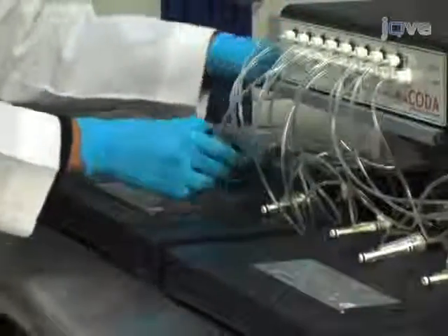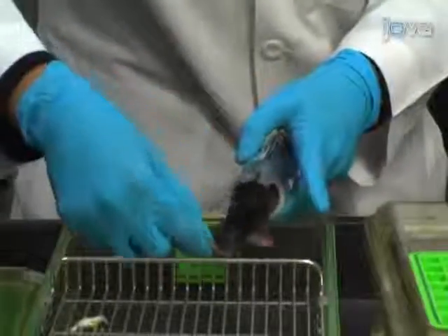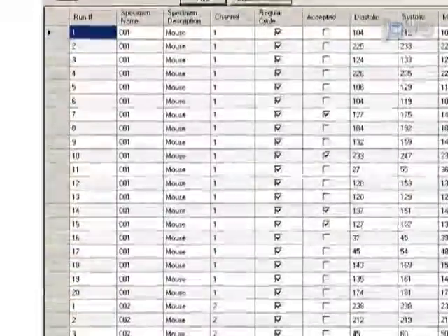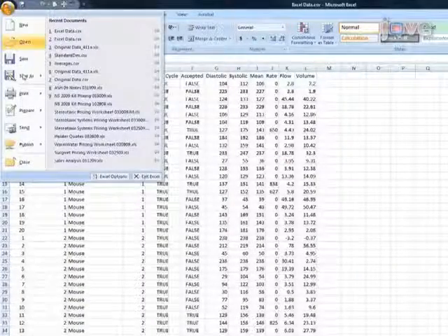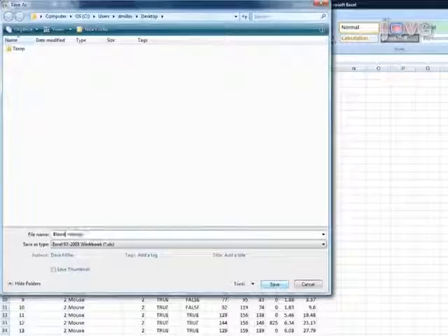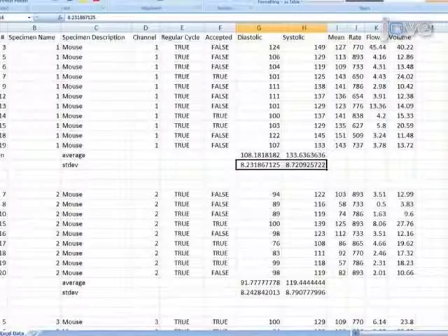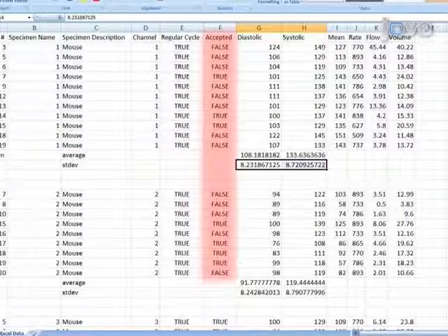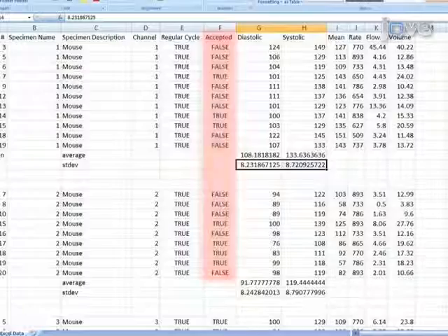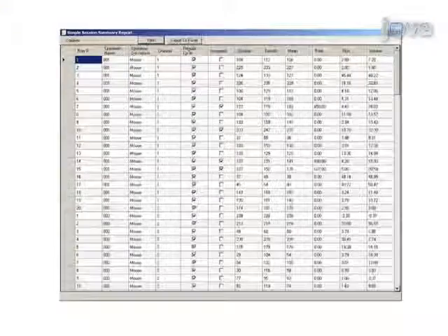When the experiment has ended, remove the animals immediately from the cuffs and holder. A simple session summary report is displayed. The data collected in the experiment is saved as an Excel file. A common practice is to obtain the average and standard deviation — delete measurements if the standard deviation is greater than 30. Additionally, rejected cycles may be viewed and the entire database can be easily exported to Excel. Consult the written protocol and user's manual for more information.